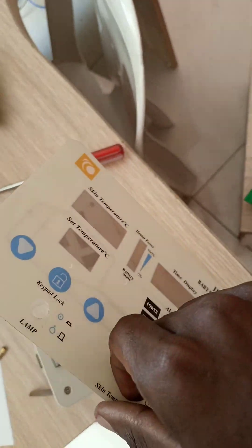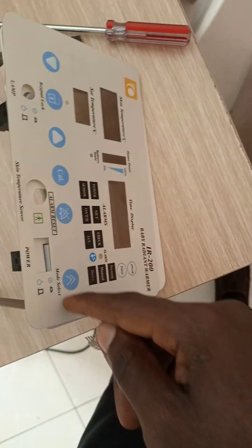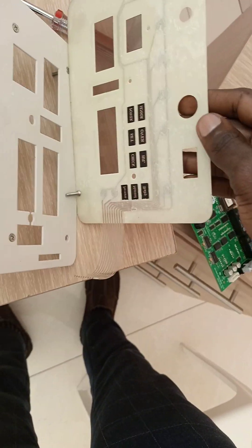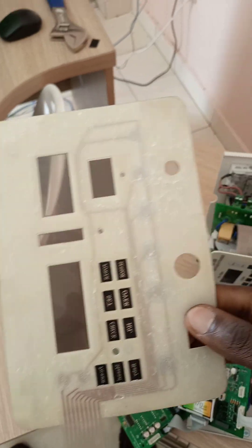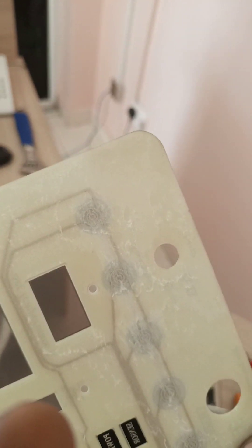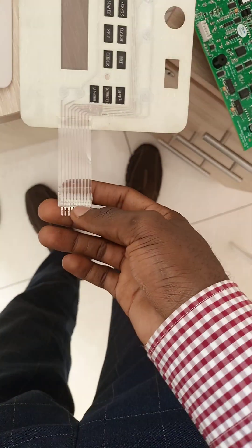The panel comes attached like this — I removed it because there are connectors here where commands are entered. This part had no problem; the issue was in just this small section. I followed up all the wires coming to this area and they were all fine — none were broken.